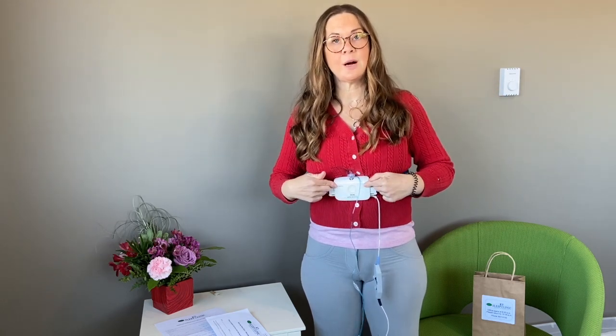You can test if it's tight enough by taking a big breath in and out — if you feel it give a bit of a stretch, you know it's working. It tells us when you're taking a breath in and out. When you take a breath the belt will stretch and tell the little box that you've taken a breath. Also, when you have both sides of the belt plugged in, that tells the machine to start recording.